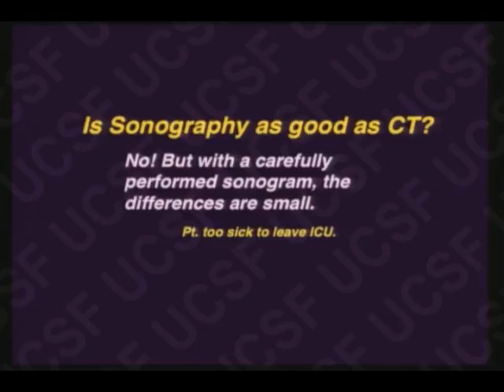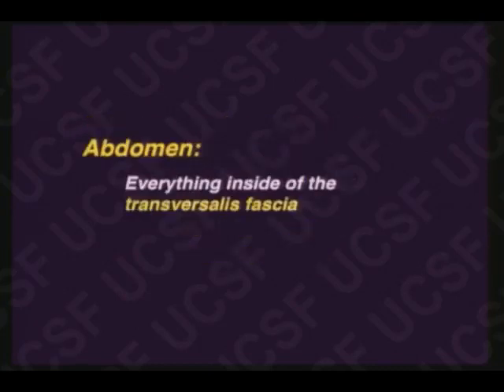So when are you going to be reliant on sonography instead of your powerful CT scanner? Well, the patient is too sick to leave the intensive care unit. The patient is too fat to get on your CT scanning table. So in the most critical situation and the technically most challenging situation, you're going to be using the technique that you probably have punted because you have CT. With those introductory comments, let's talk about some of this anatomy.